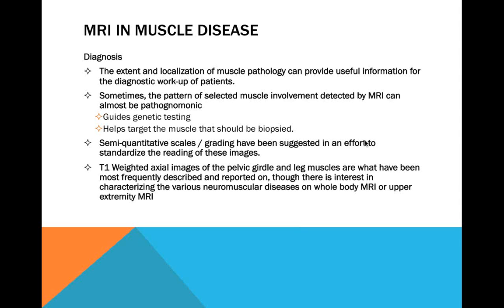The part where muscle MRI fails in my mind is that it takes 40 minutes of sitting still to get good images, and also what is the likelihood of getting a child to stay still inside of a machine like that without sedating them? So if you want to avoid sedation, or if you're dealing with patients that are claustrophobic, I would say ultrasound is fantastic. It can basically also help guide genetic diagnosis and also help target the muscle that should be biopsied. But otherwise, if you have the opportunity and the funds available to do a muscle MRI, I do think that muscle MRI is definitely superior.